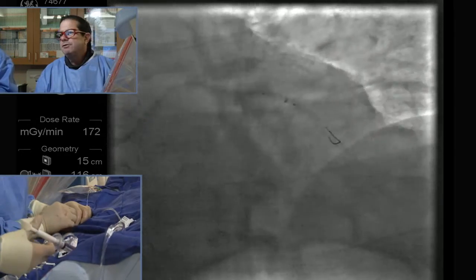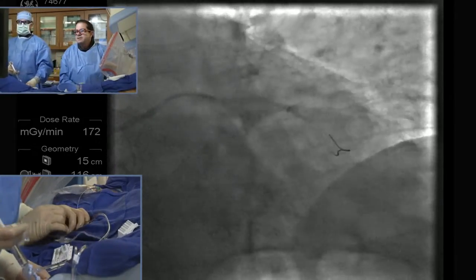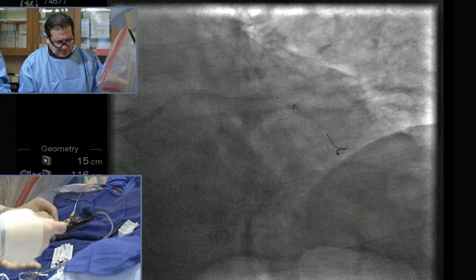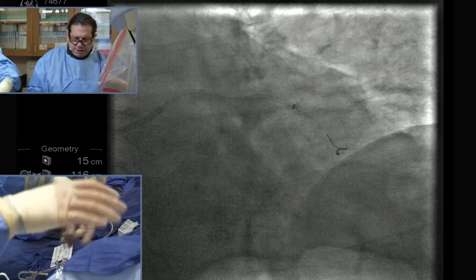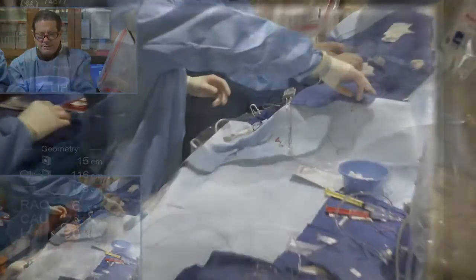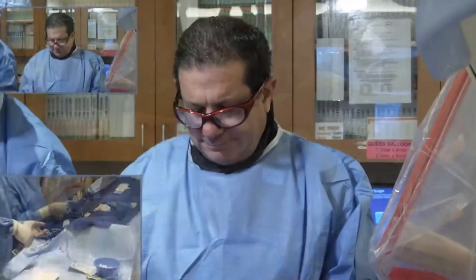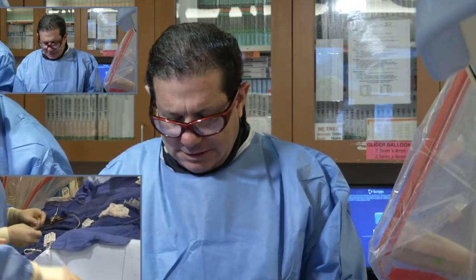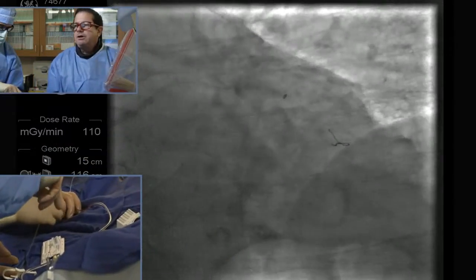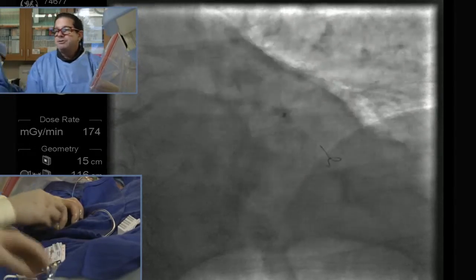Let's try the stent now. Not wanting to go — that's annoying. Give me an 8 NC, a 2.25, 8 NC balloon. So this is what we're talking about by complex PCI — it's a perfect example. This is not something that can be done by the casual interventionalist who's got 30 patients in clinic to see after the case, because these cases take time and require a commitment. I feel pretty strongly that if you're not doing 150, maybe 200 a year, you shouldn't be doing these.